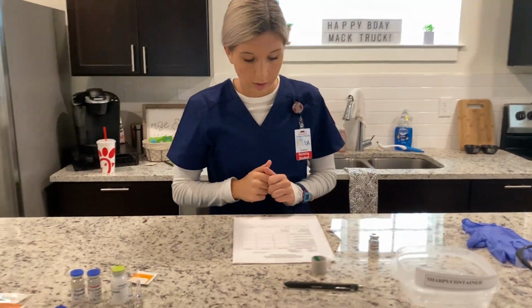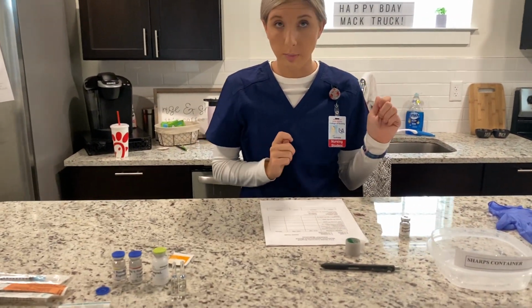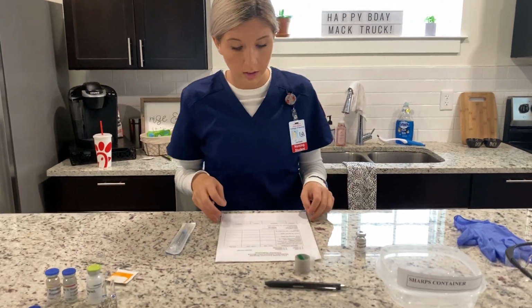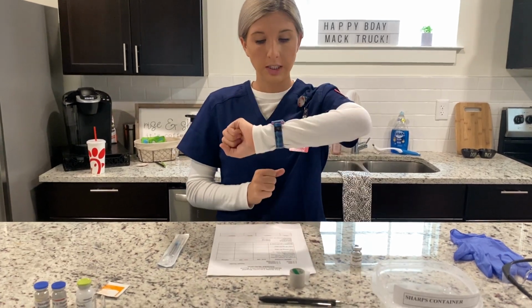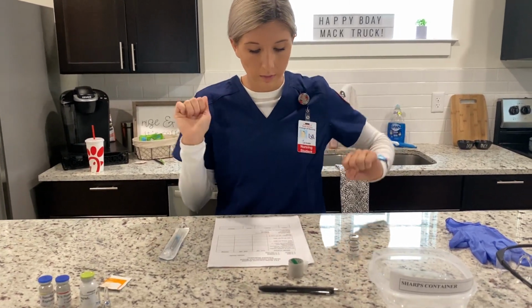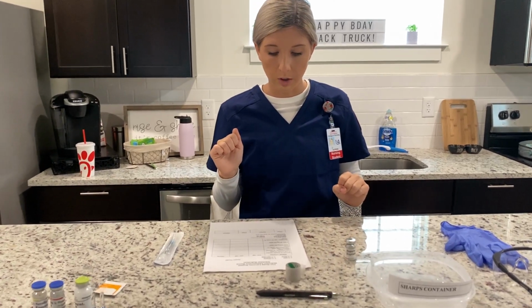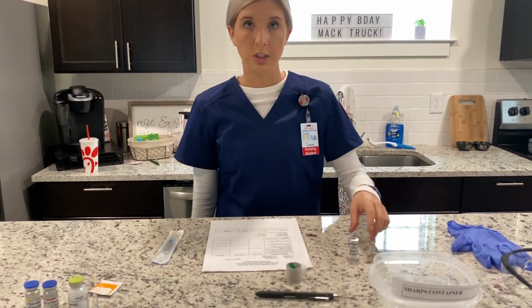And then I see that it is subcutaneously, so I'm going to grab the TB syringe, which is 1 milliliter. And then I'm going to check the time, and I see that it has not been given in the past 12 hours like the MAR says. And then I'm going to do my calculations.